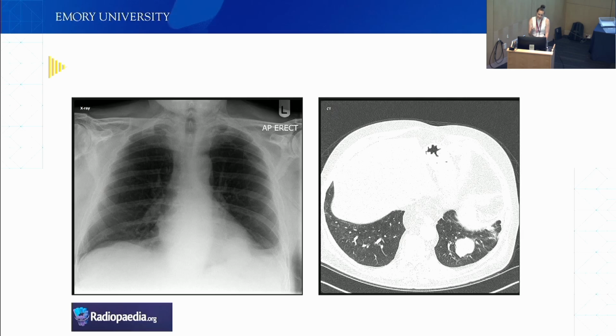Well, and I think the point is that the reason why we do X-rays is because they're done earlier, faster. So very often when a radiologist looks at it, the CT image is not done. The CT image is done when a radiologist says, hey, there is something worth making a CT. But since we train retrospectively, if you want the best reference standard, see if there are CT or MR images. But it doesn't necessarily translate to clinical use one-on-one, because that CT image won't be there at the same time.